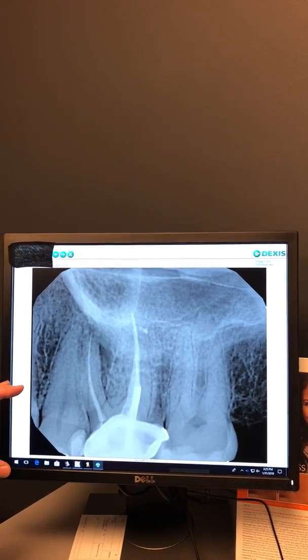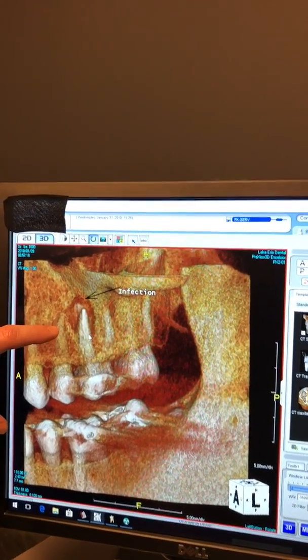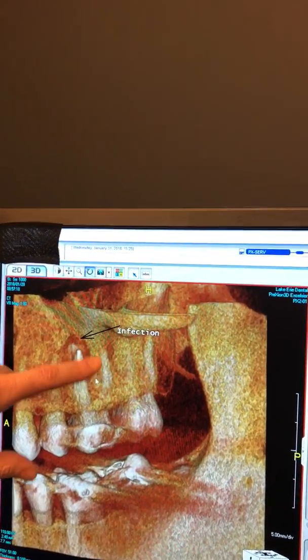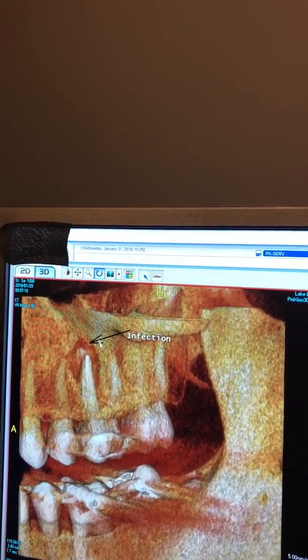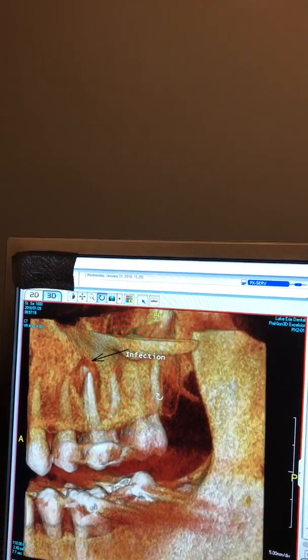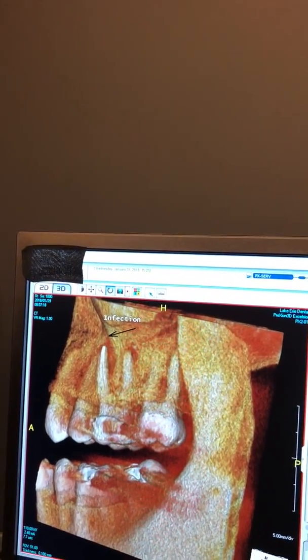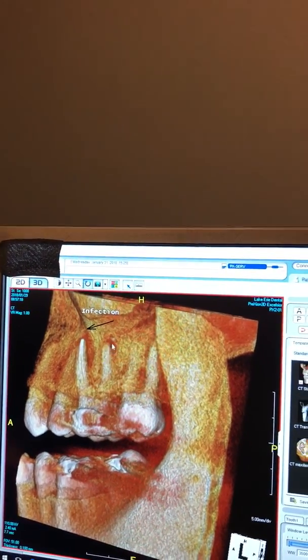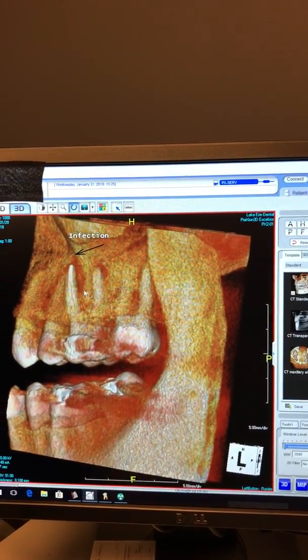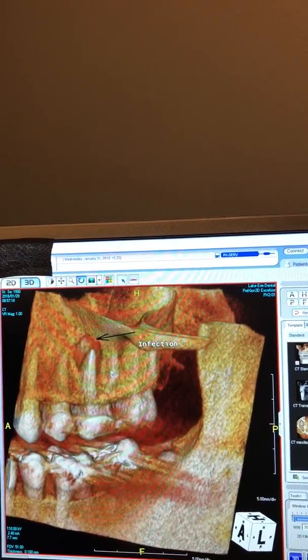Here's a case that demonstrates how much different it looks when viewed three-dimensionally. We took a cone beam image of this patient, and when we look at this we can see healthy bone around these teeth — but when we look at this tooth, you can see the big void and the big hole in the bone where there's a significant infection. Moving this around because it's three-dimensional, we can look at the back of the same root and see a large infection forming, actually eating away at the bone around that tooth.